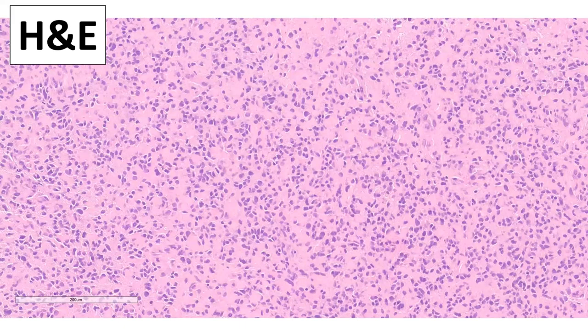All right, and here's the histology. I'm not sure if you can appreciate, if you look very closely, there's a very high percentage of gemistocytes here with the globular eosinophilic cytoplasm. That's the histology of this particular glioblastoma. There was microvascular proliferation. There was necrosis, et cetera. All right, this is the context.